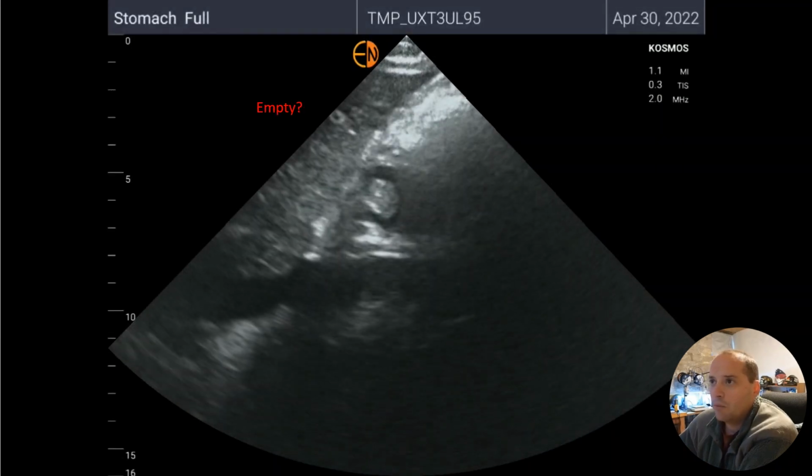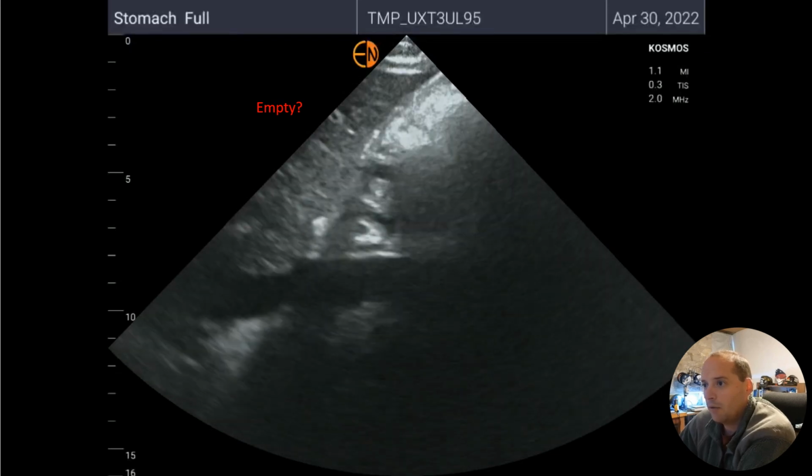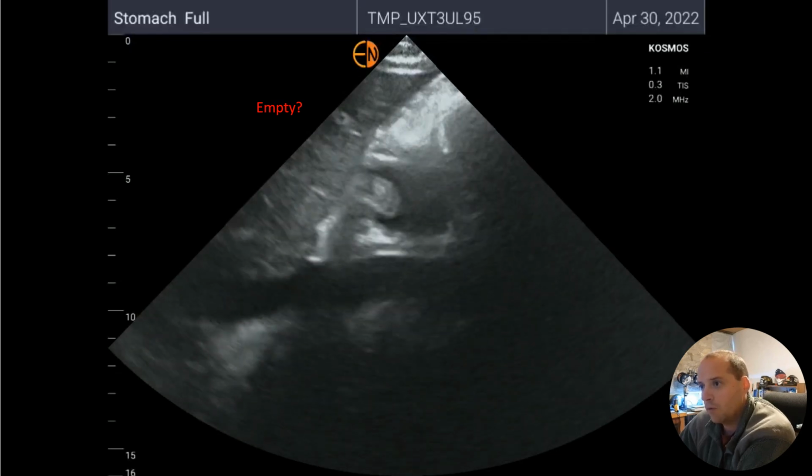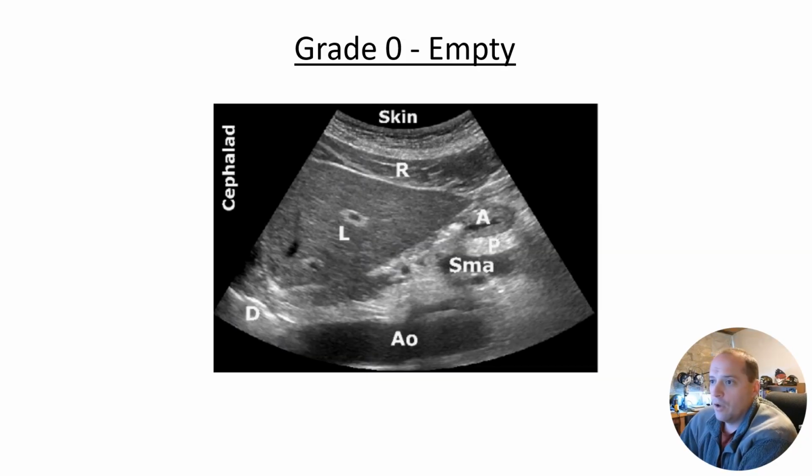We talked about this one before. We had seen the liver edge and this pulsatile vessel back here, and we're not really quite sure. It might look like we've got a multi-layered, small contracted wall here, but if you notice, it's actually the IVC.